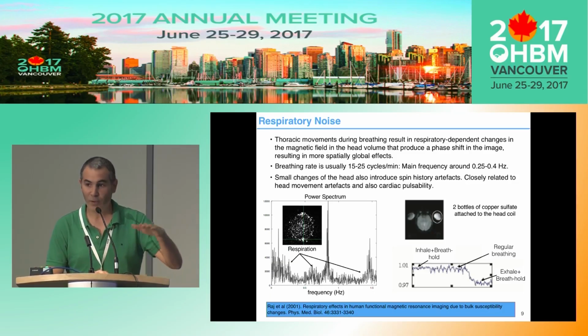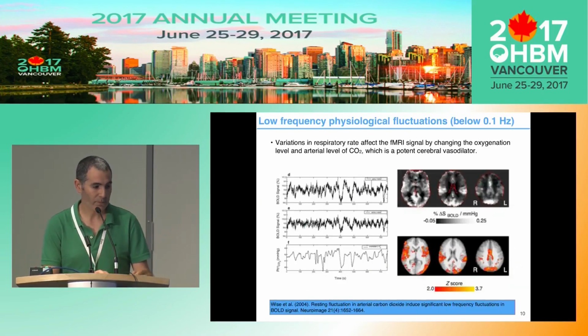And you see that there are no fluctuations during the breath holding period. As soon as they instruct the subject to breathe normally, these changes in the phase of the signal create oscillations in the time series. Later, if they ask the subject to do another breath hold, those periodic fluctuations disappear.